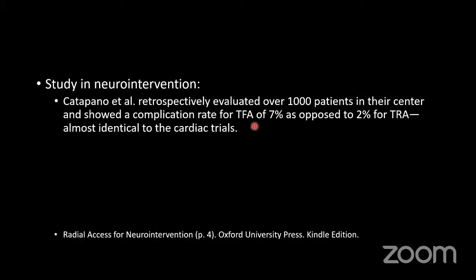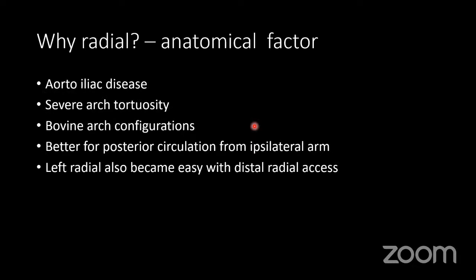In a study in relation to neurointervention, Catapano et al. evaluated over a thousand patients and found that transfemoral access has a 7% complication rate as opposed to a 2% complication rate for transradial access. And it is almost identical to the previously done cardiac trials.